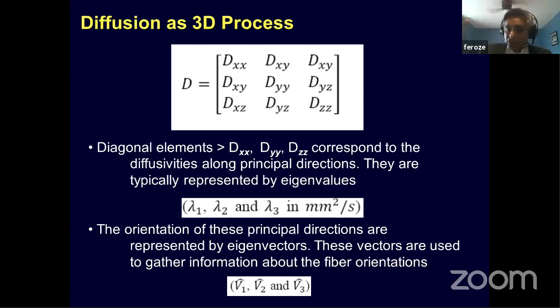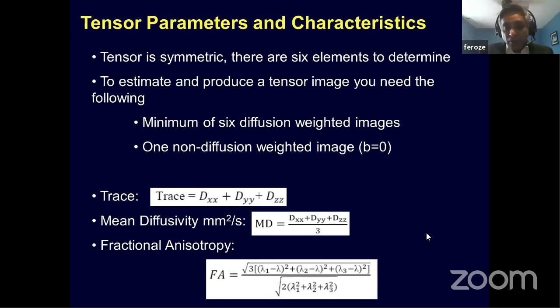As we know, a vector is direction. Here, with a tensor, you're able to measure the vector movement in 3 dimensions, right? Once you have that, you can use those formulas to actually calculate a few things. And if you remember from our previous discussion, a few slides back, isotropy, right? Whether the molecule is anisotropic or isotropic. So it's called fractional anisotropy that you can calculate. This tells you the directionality of the water molecule. One can also calculate the diffusivity, how fast it is diffusing.